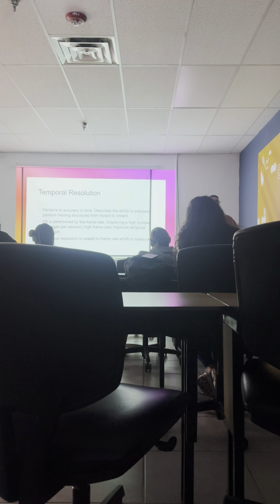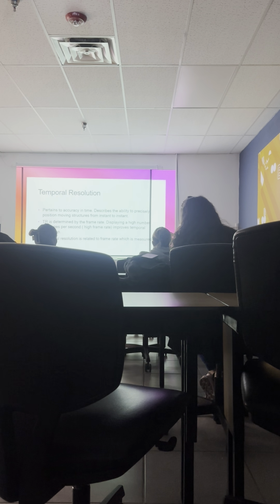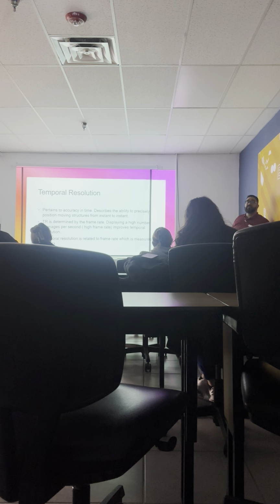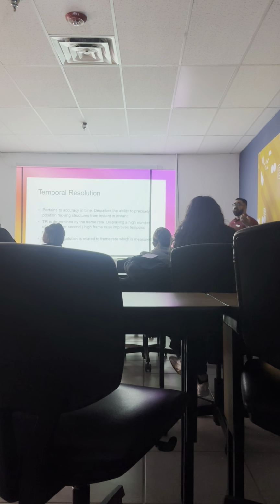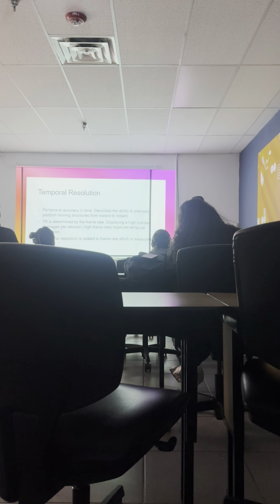Color Doppler. In motion. Motion, what type of motion? Not the blood, okay. So it's relative, yes, cardiac. For the Doppler strip, it is relative, but not so much. What we're talking about is cardiac. So what does the heart do? It pumps. It expands and contracts. Now what's happening inside the heart? It's beating. No, inside the heart. Circulating. The blood is going through valves, right?